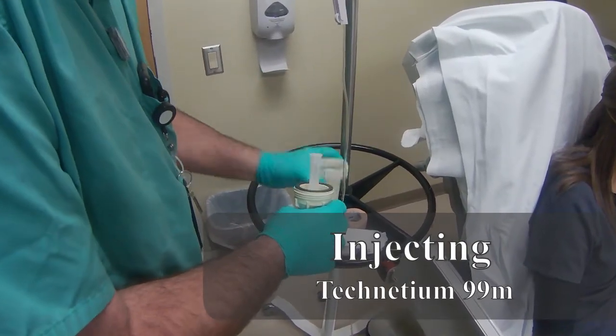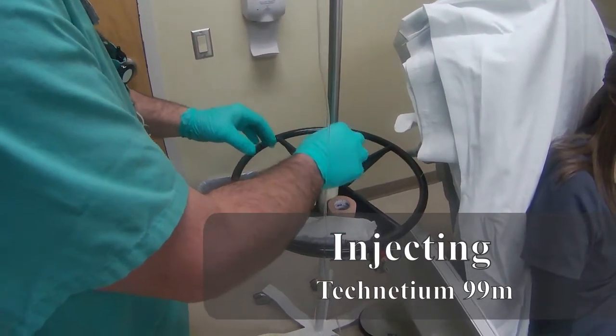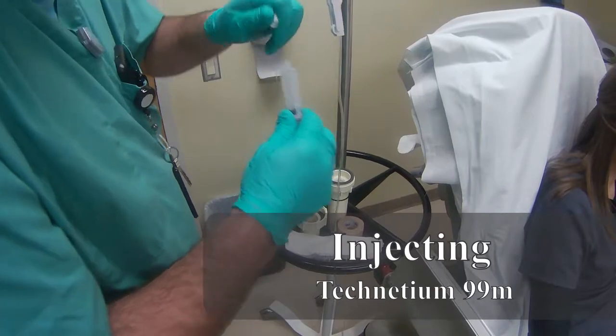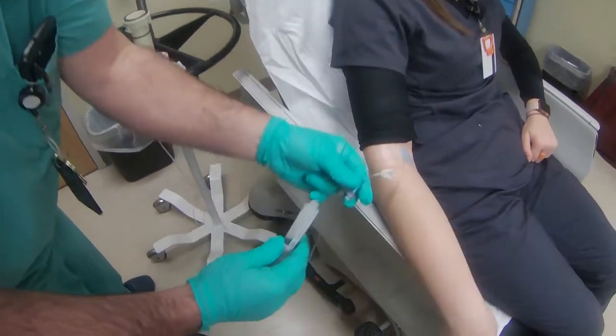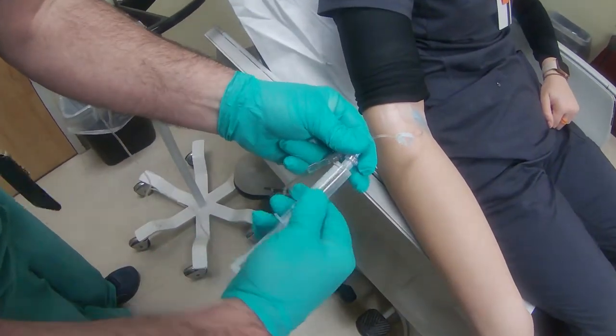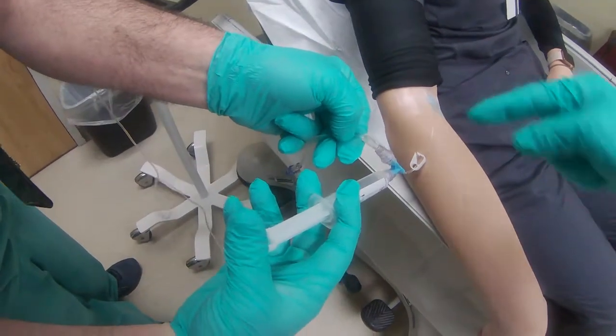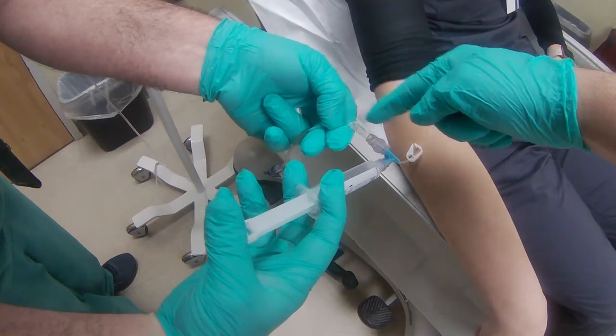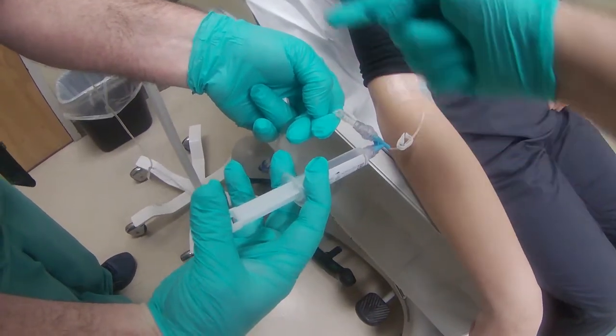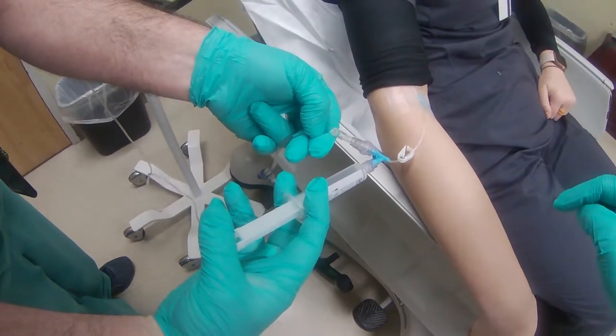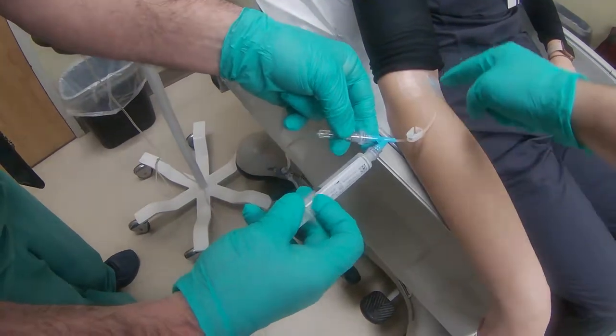And then he will inject it into the patient's cannula. Make sure that he will obstruct this so that the nuclear material does not go back to the saline. Instead, it will go through the cannula.